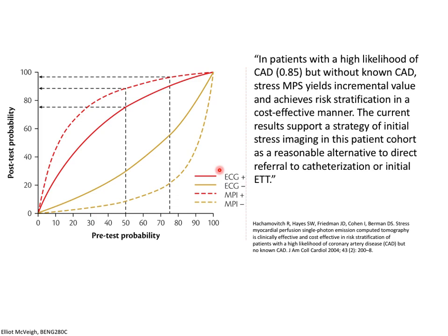So if I come in and for whatever reason, I have diabetes, I've smoked, I'm 68, you put all of these factors together and you decide, you know what, your pre-test likelihood of having coronary artery disease is 75%. If we look at all the people that have your characteristics, 75% of those people have coronary artery disease. And you ask the question, well, is it worth actually having a SPECT scan to determine whether or not I do have coronary artery disease?